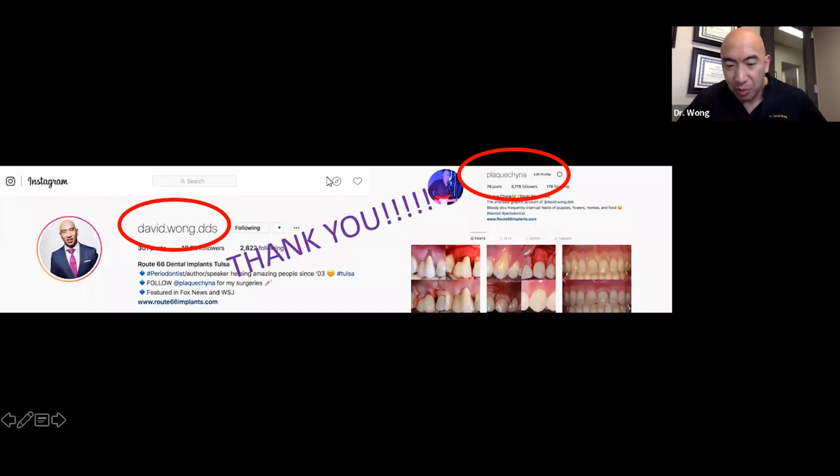To be honest, if you ask me, I still graft the same day. But if you ask some other people, they'll say to do a delayed approach. We're both right. It's whatever works best in your experience and in your hands. The safe bet, if there's a lot of purulent exudate, a lot of bleeding and oozing, some people will just take the tooth out and get the infection cleared out and then come back usually within 4 weeks to finish up the graft part.